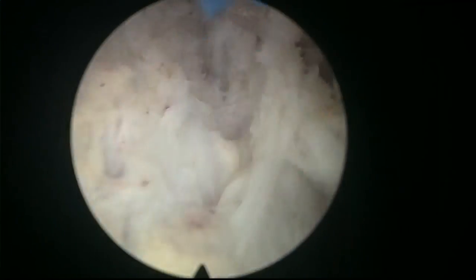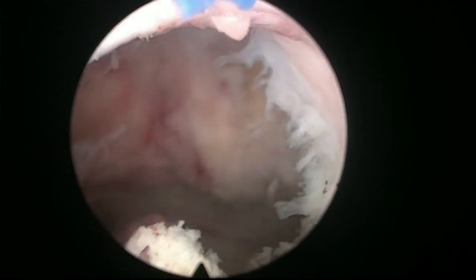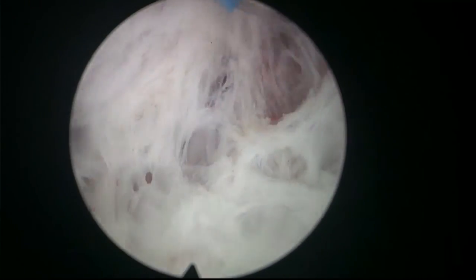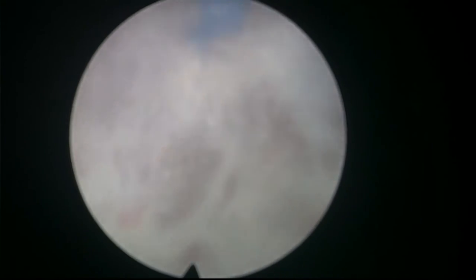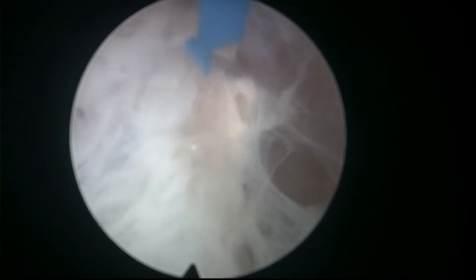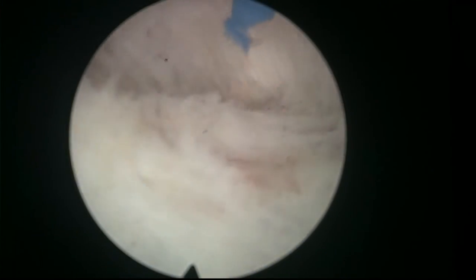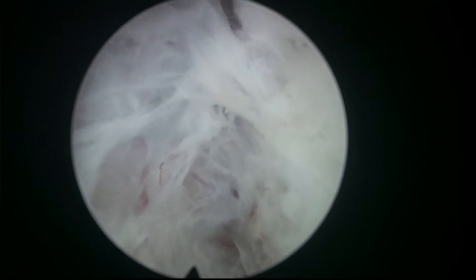That's the dissection of the anterior plane. The fiber is firing against the line of attack, the sphincter is properly preserved, and the apex is totally dissected and free. This is where I think beginners should start — when you're learning the procedure, someone should release the apex and then you can do the circumferential dissection to get used to the fiber and instruments.